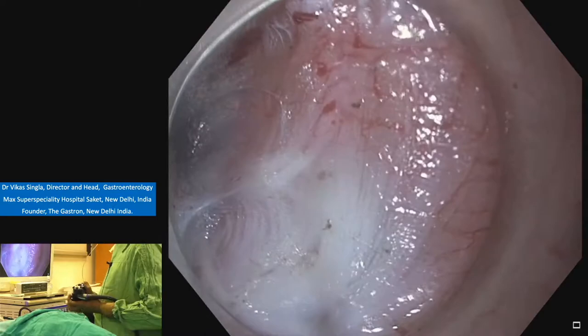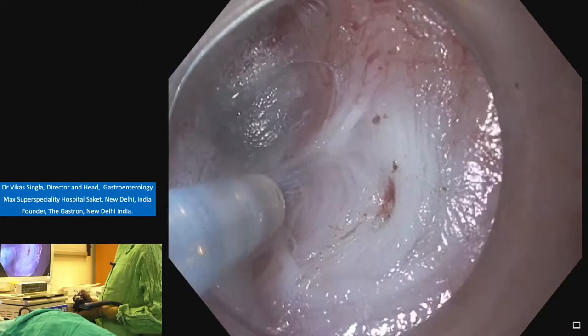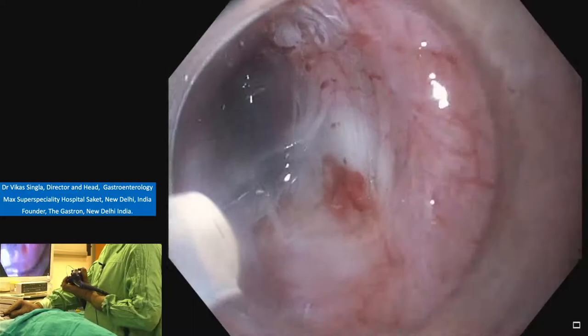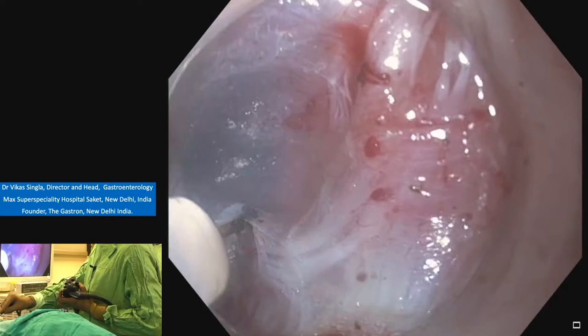You can see some splitting of muscle on the right side. So one should take precaution not to enter inside the muscle layer. Otherwise, there will be muscle layer on both sides. The plane should be in the submucosa only. Bleed there. This can be controlled with the forceps only. So again, submucosal dissection.